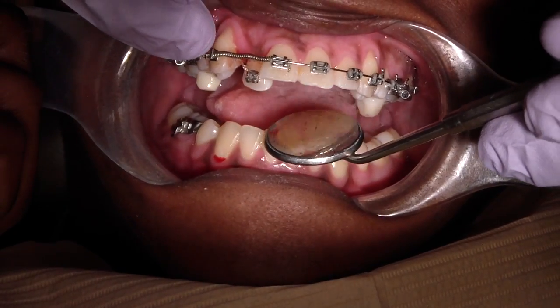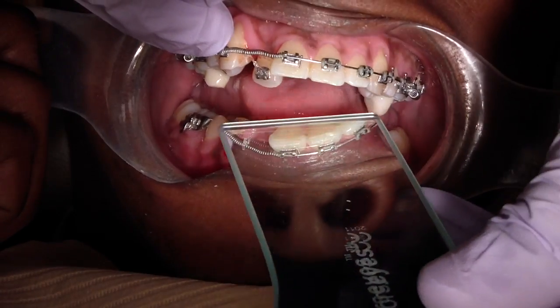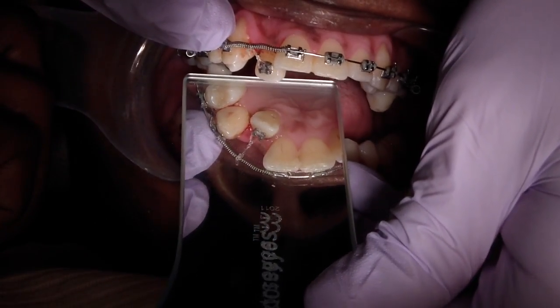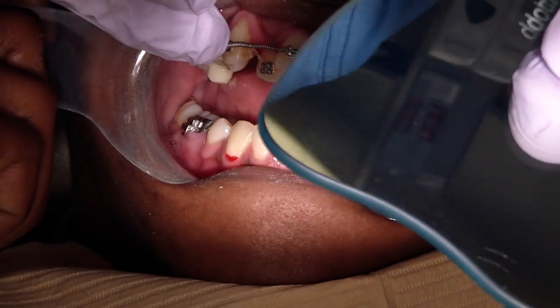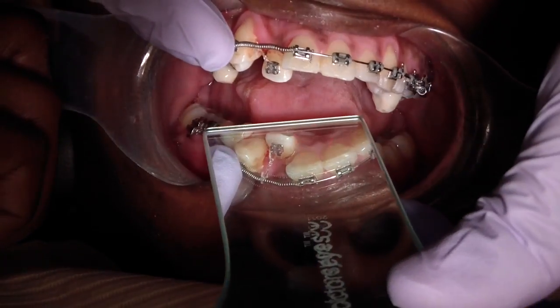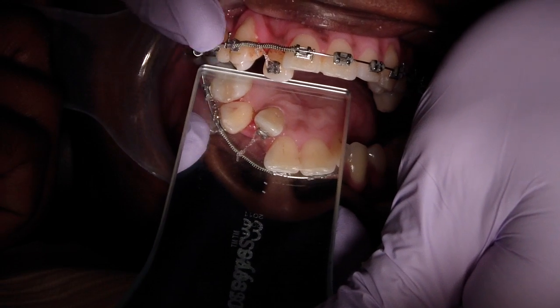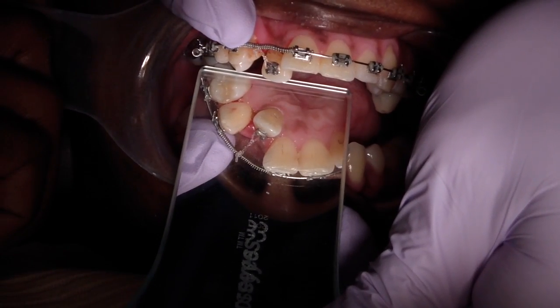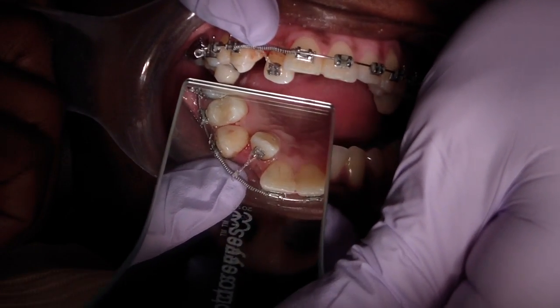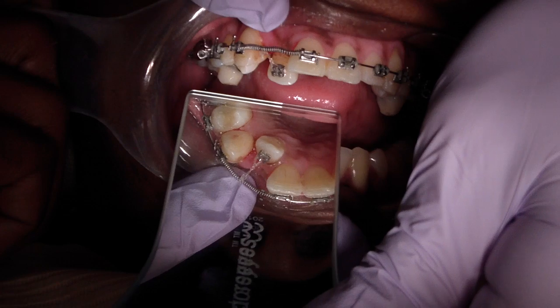Just open for me. She's excited to finally have this lateral incisor start to become positioned facially, so we used an open coil spring to expand and achieve almost sufficient space — we have to do a little bit of interproximal disking. But what we've done now is we've kept the open coil spring, and now we place this material called power thread or action line — it's an elastic little line. We place a bracket on the incisor and we're just going to pull this facially.